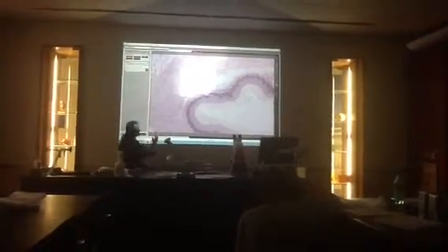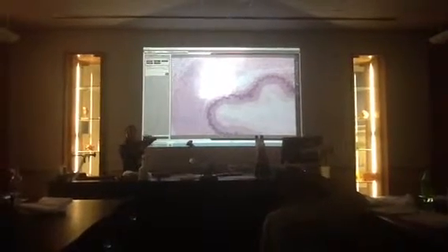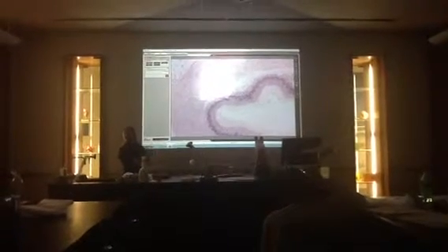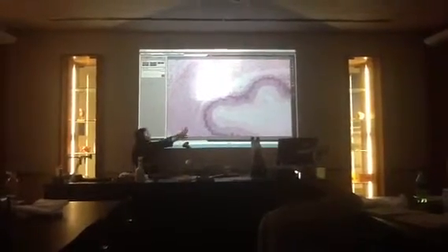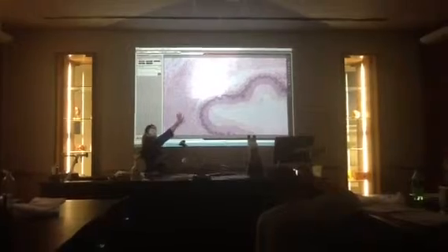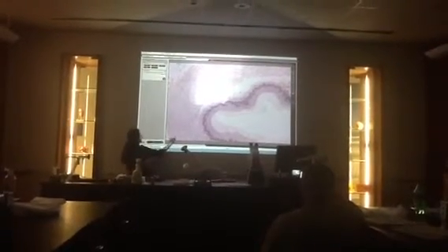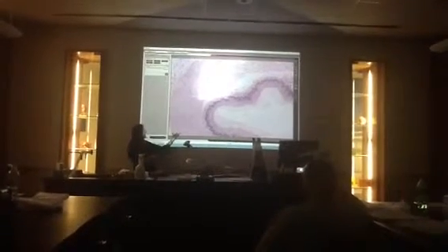It looks like it's made up of little circles, because of the way it's cut. Think of a bunch of straws you have in your hand. Those are the ends of the straws you see, so the little circles. That's longitudinal because it's running the length of the esophagus. So circular is the circular layer of the muscularis externa, the larger one on this slide. And then the longitudinal layer of the muscularis externa is the smaller outer layer.